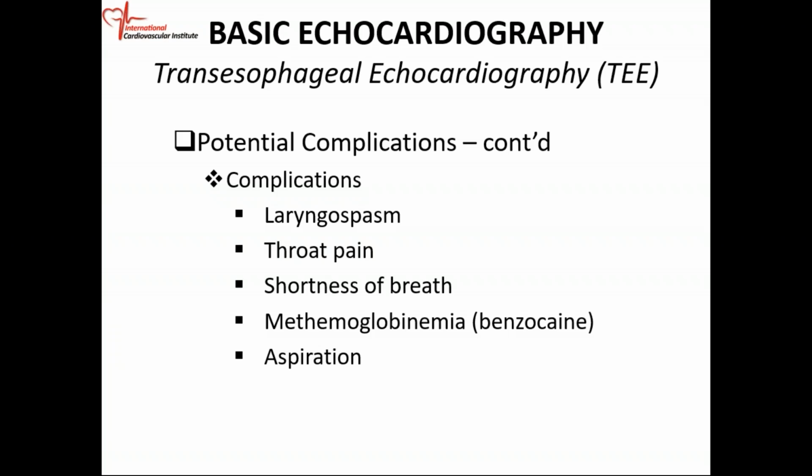After the procedure, the patient can complain of pain in the throat because you're putting this probe in the back of the throat into the esophagus. Shortness of breath, okay? So they can develop shortness of breath if they aspirate, or even from the laryngospasm.